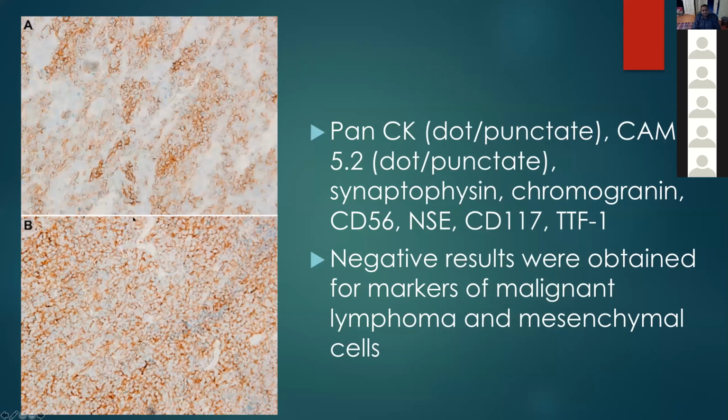This is an example of CD56. And pancytokeratin, you've already picked up something. What do you know about this? One, it is a carcinoma. Two, it is of neuroendocrine origin. My diagnosis is made.